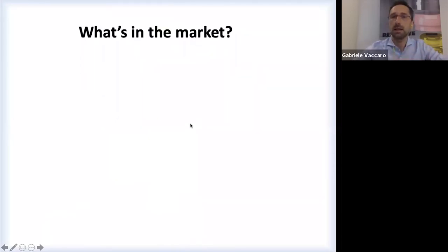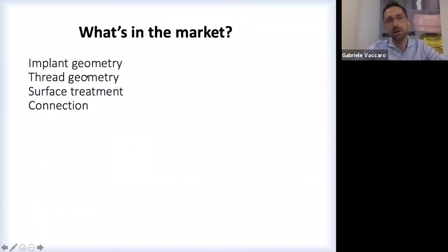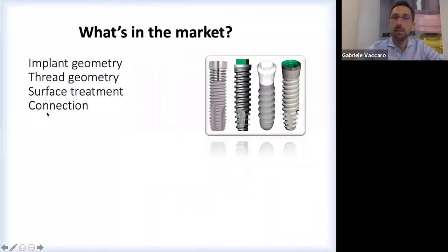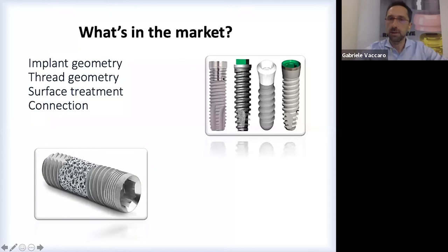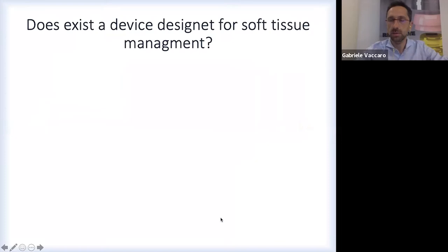So let's see what's in the market for the management of the soft tissues. The market is more orientated to the implant geometry, thread geometry, surface treatment of the implants, and the connection between implants and the abutment. And we have everything in the market, from completely polished implants to trabecular implants. So they said everything and the opposite of everything. Because the main goal of the market in implantology is to gain as soon as possible the primary stability, to gain the immediate load, and to gain as soon as possible the secondary stability.